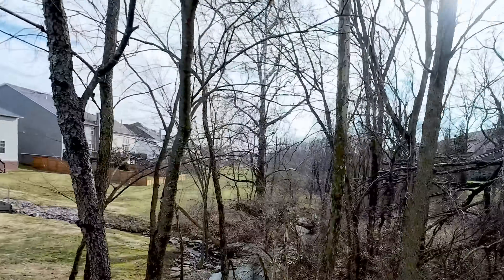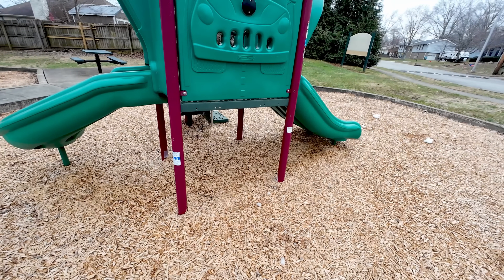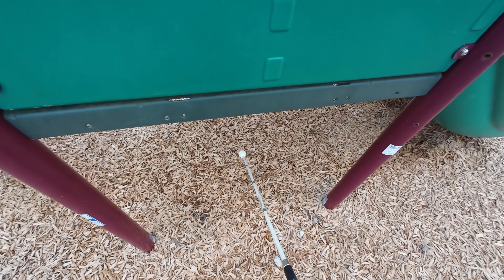Let's talk about how the WeWalk Cane detects obstacles in front of you. First and foremost, it's just a regular cane, so it can detect obstacles waist level and below like any regular cane. But what makes it unique is the ability to detect obstacles waist level and above. For example, this playground equipment has a big open space underneath it — so as I walk up, my cane goes right under it, not telling me anything is there until I run right into it. The WeWalk's obstacle detection alerts me before that happens.